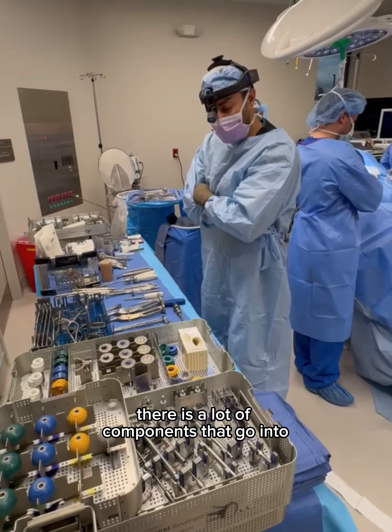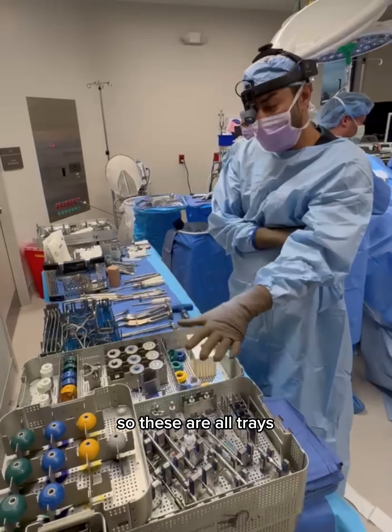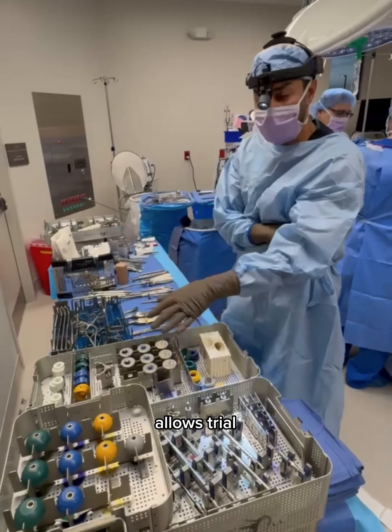There are a lot of components that go into the instrumentation that we use to replace the shoulder. These are all trays and they have different types of instruments that allow us to trial different things.